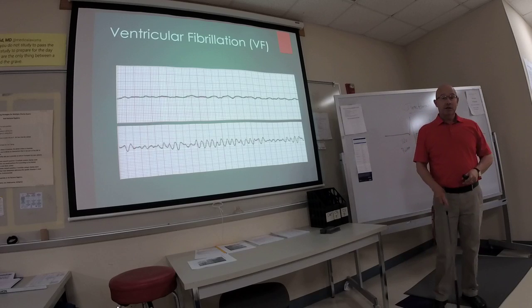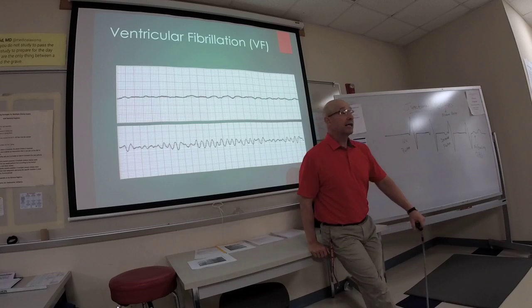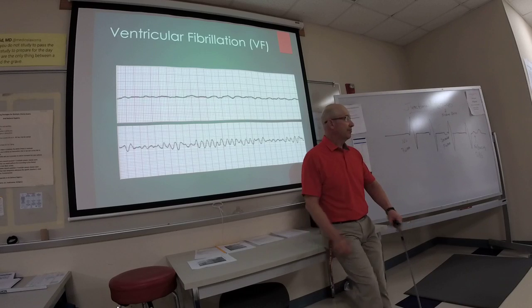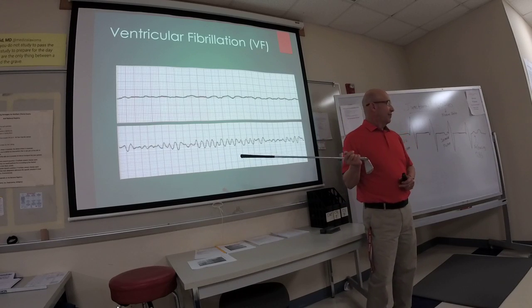I hate how sometimes the monitors aren't good though. We try to tell them, they're like, oh, it's just the monitor. Well, that's true. Because if the patient's looking at you and talking to you, they're not in V-fib. They need to be dying.